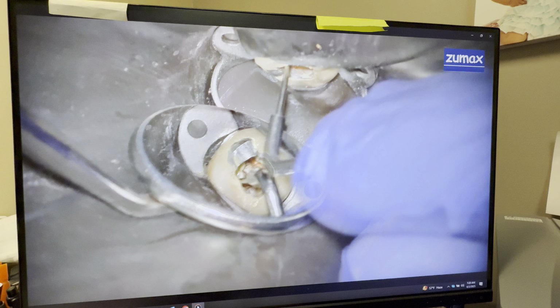All right. We're going to need to place the rubber dam, and take a look here. I'm using a premolar clamp, and I'm using the thickest rubber dam that they sell on the market. These are really thick because we use chloroform, and these don't dissolve right away if they're exposed to chloroform. If you get a drop of chloroform on them, unlike the other kind that we use for regular root canals, these are very resistant to chloroform.